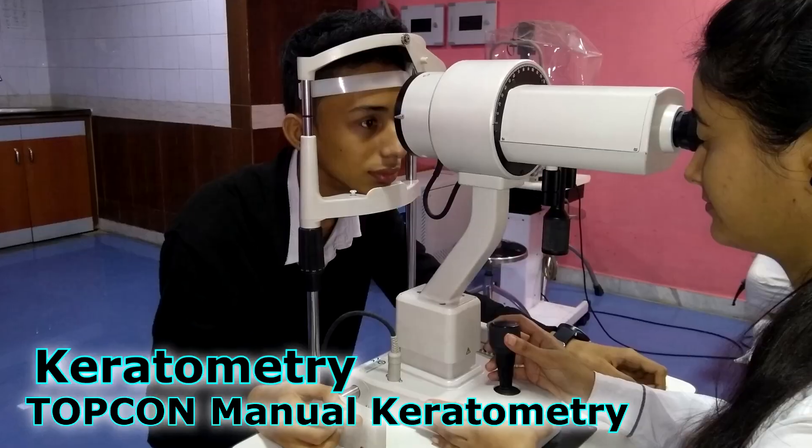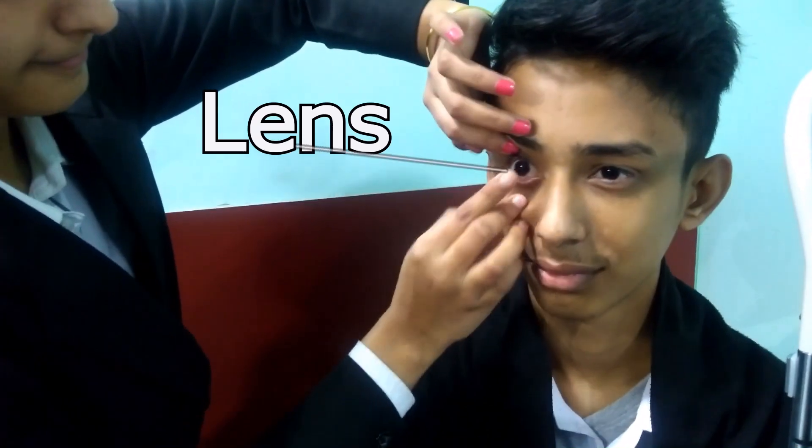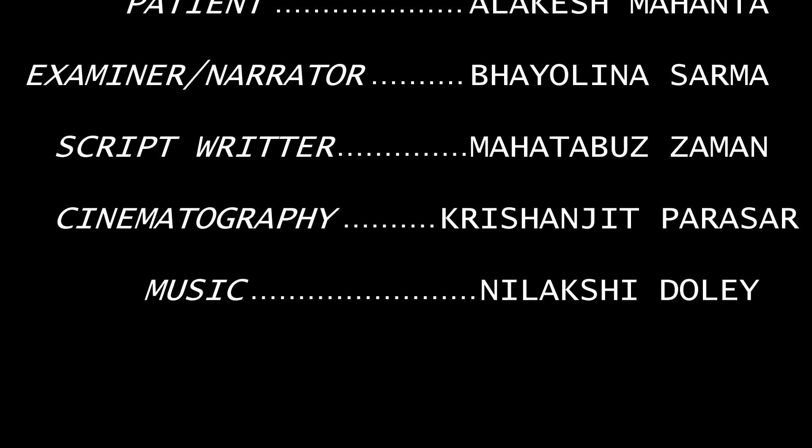Through this video, we tried our best to demonstrate briefly the RGP contact lens fitting and dispensing procedure. We hope you all got some insight from this. Thank you.